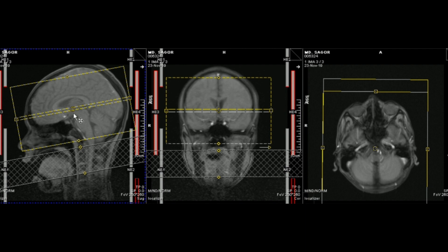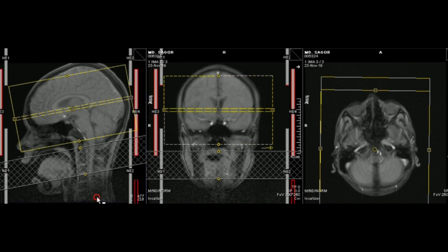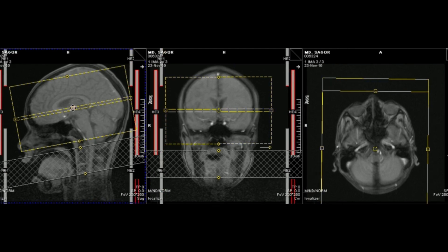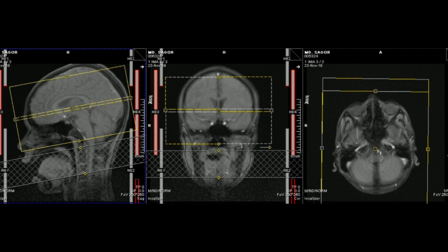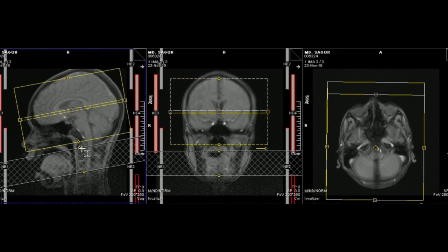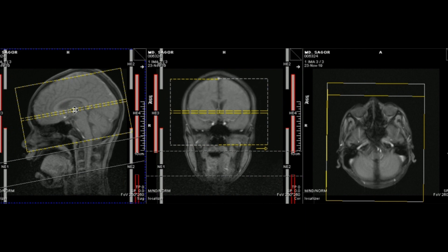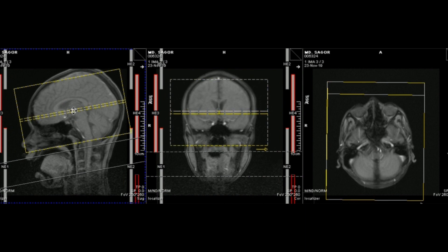The plan will be parallel to the genu and splenium of the corpus callosum and should cover from the foramen magnum to the vertex, covering the whole brain. For a tilted head, plan on the coronal image — the slice will be perpendicular to the third ventricle and the brainstem.